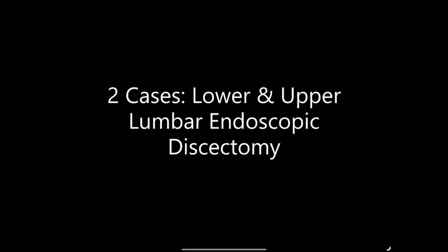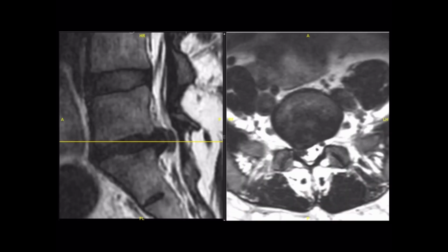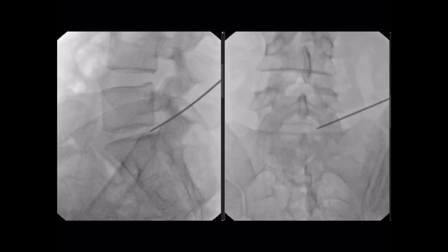Hello, today we will be reviewing two endoscopic discectomies performed by Dr. Albert Telfeian. First case is a transforaminal approach to a right L5-S1 disc herniation. Patient is awake under conscious sedation for this procedure. Here we have the preoperative MRI showing the herniation.